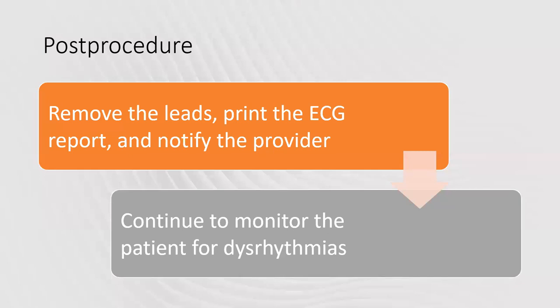Post-procedure, you remove the leads, print the ECG report, and notify the provider. And you want to continue to monitor the patient for any dysrhythmias, because this 12-lead is basically just a quick picture. It's a snapshot of what's happening to your patient.